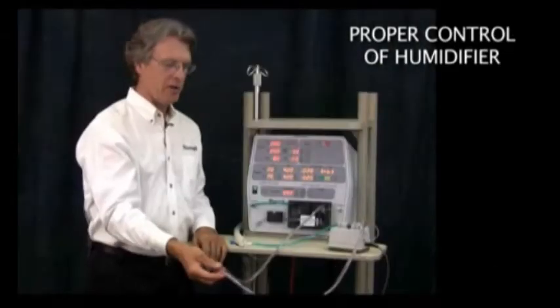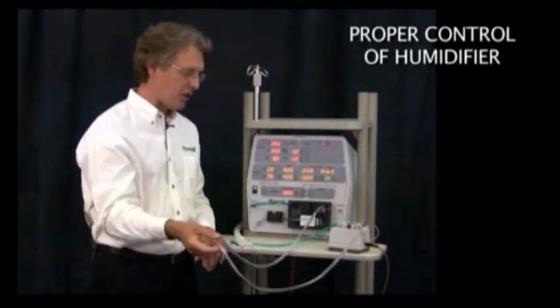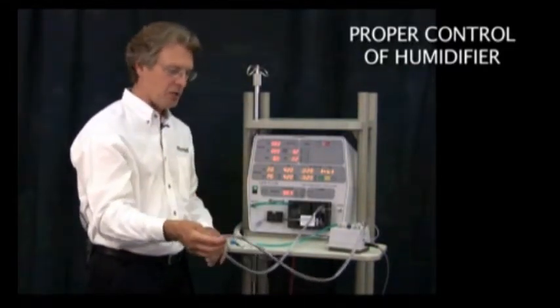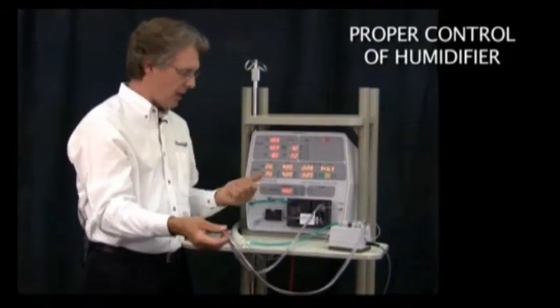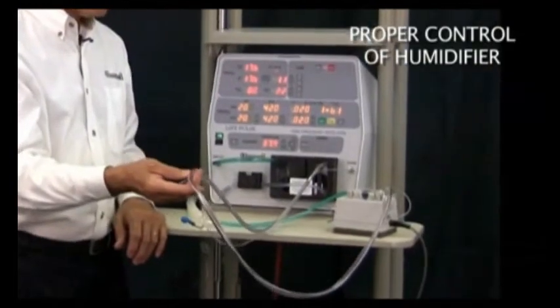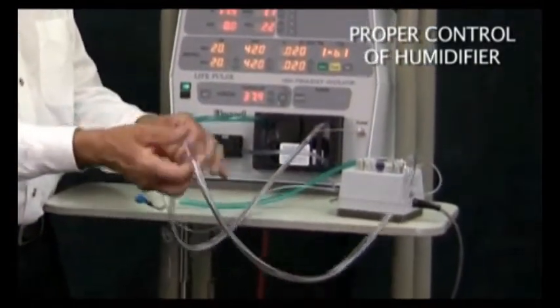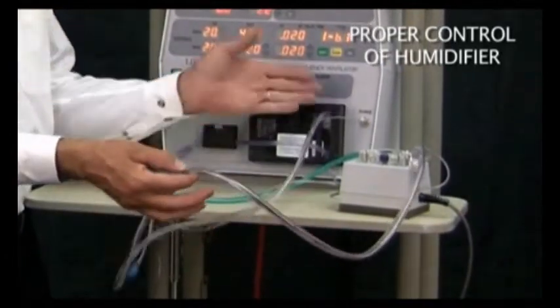In your intensive care unit, where the air conditioning ducts are, where the doorways and hallways and traffic patterns are, the environmental conditions may be such that the default settings result in too much water being put into the gas flow and raining out in the jet ventilator circuit in this clear portion of the circuit between the front of the ventilator and the patient box.